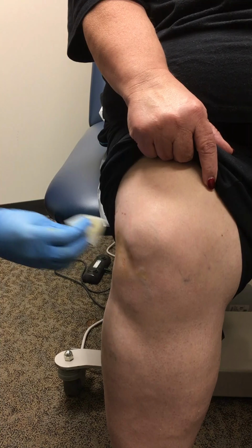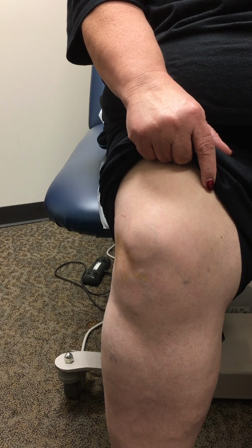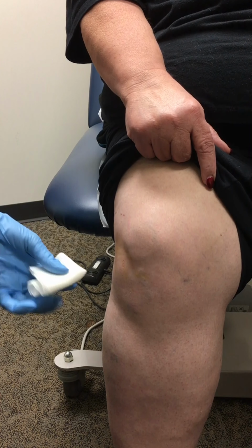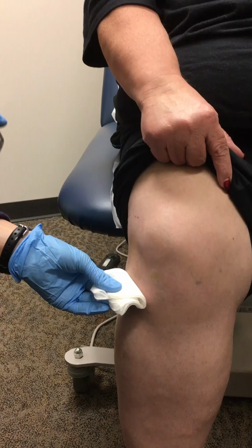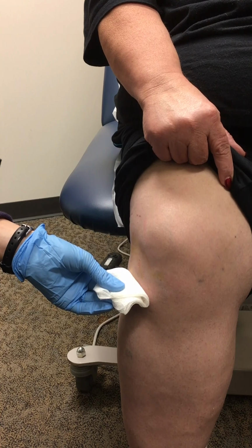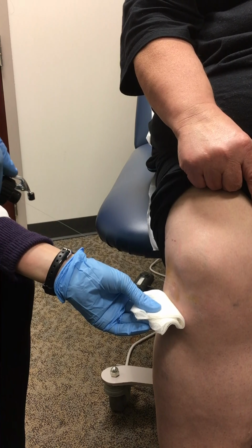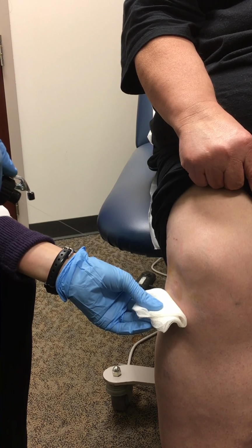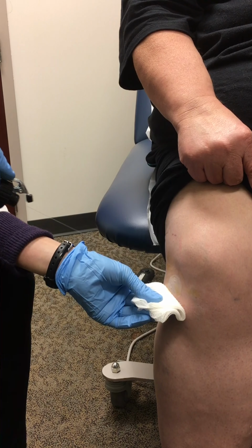Alcohol wipe. The cold spray tends to run down their leg, so I like to place the gauze underneath where I'm going to spray to catch, and then I do 10 to 12 inches away from the knee. And wait until it starts to turn white, blanch. You getting nice and cold? There we go.